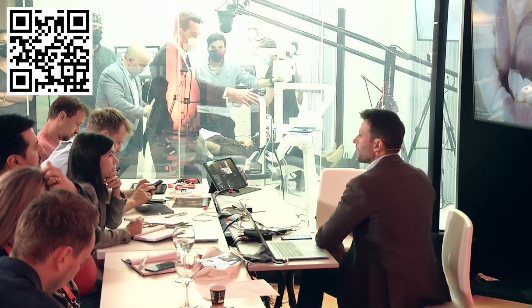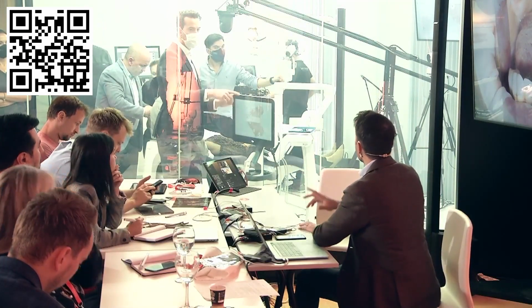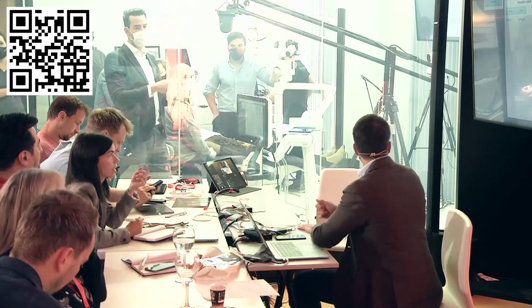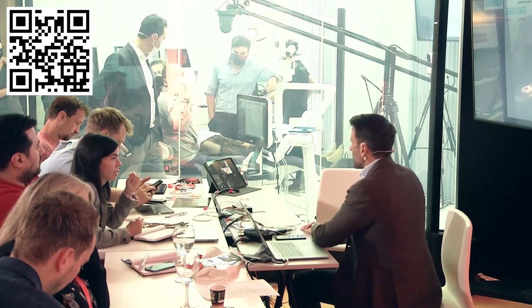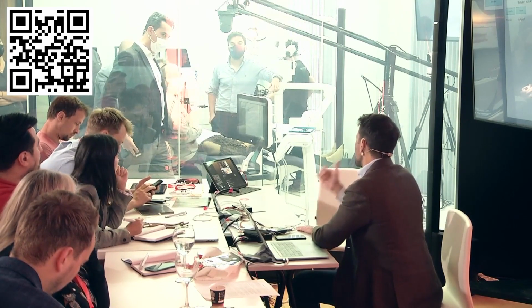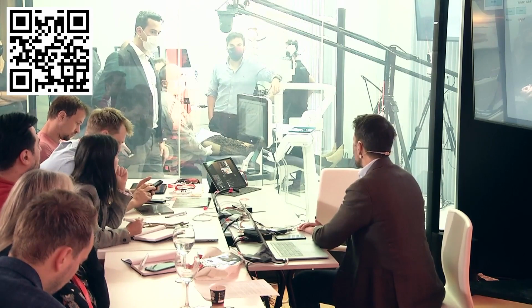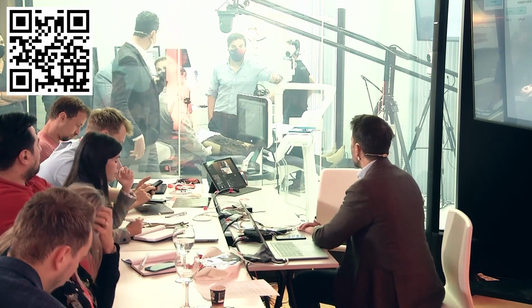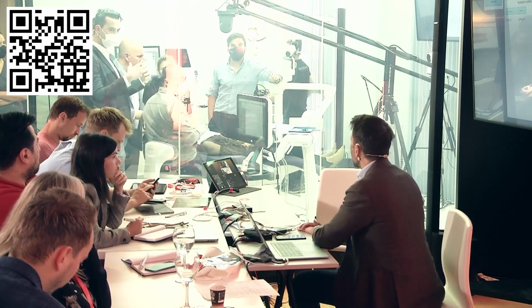The Tero is sending the file. So while the Tero is sending, we're going to try now the aesthetic and the passivity, and then we're going to scan the prosthesis from the internal part. In this project, you're not going to scan the lower because you scanned the lower already on the other project. We're going to do now the aesthetic and the passivity at the same time because they are both together.